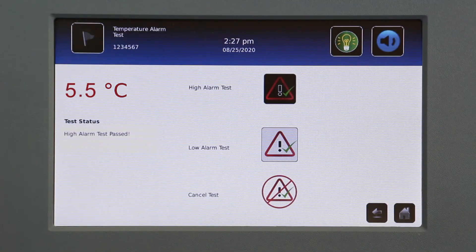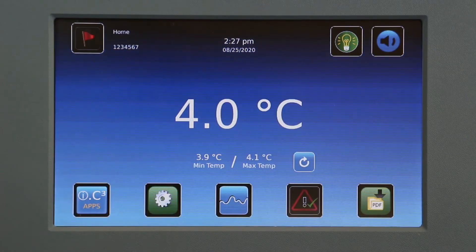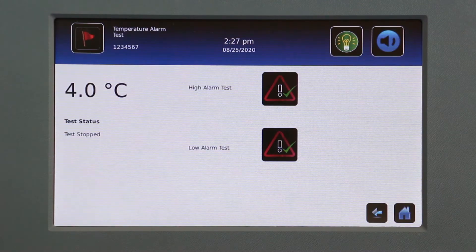The Automatic Alarm Test also allows the user to verify that the alarm activated at the appropriate temperature. To initiate an automatic alarm test, touch the high or low test icon.